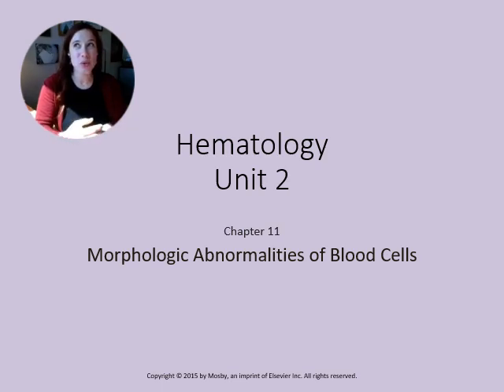We're going to follow up from talking about blood smears, making those and all that. So not only is it important for us to know how to make it, how to look at it, and what we're looking at, we now need to know what abnormalities we can see. Because it's great to see things that are normal, but are all of our patients normal? No, that's why they're patients.